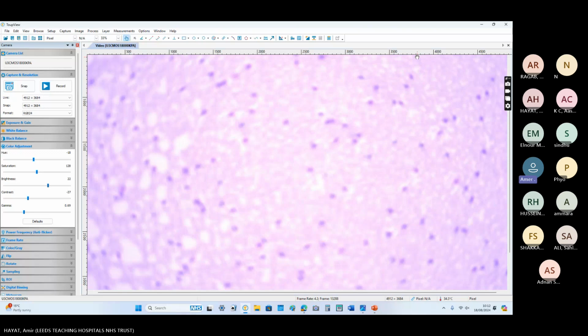Then when you say that you would do further investigation like flow cytometry, he would give you flow cytometry. This is the flow cytometry to make your diagnosis. Then he would ask you regarding prognostic factors, which include multiple mutations and translocations.